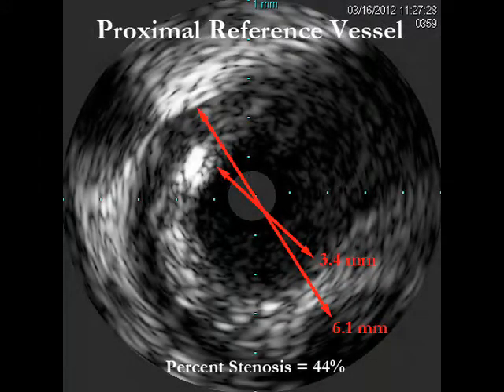After the study is complete, the vascular sheath is routinely sutured in place until the activated clotting time returns to baseline. Once the activated clotting time returns to baseline, the sheath is removed. Once the patient is felt safe for transfer, he or she is attached to a hemodynamic monitor and transported to the appropriate post-procedure recovery area.